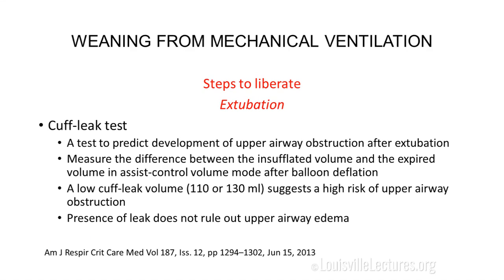And then finally, if the patient passed the spontaneous breathing trial, you're going to go ahead and extubate. Okay? So the cuff leak test is a little bit controversial. Some centers do it routinely, others do it on patients who they feel are at risk of laryngeal edema or post-extubation stridor. So what is the cuff leak test? It's a test to predict development of upper airway obstruction after extubation. It measures the difference between the insufflated volume and the expired volume after balloon deflation.